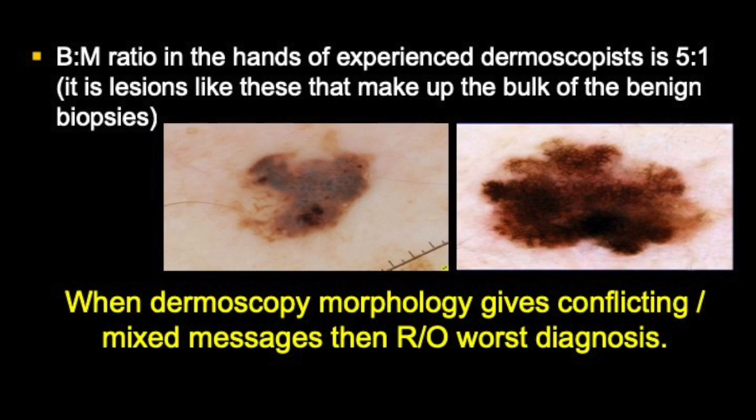And what's happening to seborrheic keratosis? It's a flat line. Which means that everything that we wanted to know or could have learned about seborrheic keratosis was already learned way back then, and nothing new has come. And those other lesions are being biopsied today as they were being biopsied 10 years ago and 15 years ago, because we have nothing else. It's the end of the road, and the only thing would be now some other tool, whether it's confocal microscopy, OCT, whatever you can think. But dermoscopy, that's the end of the road.